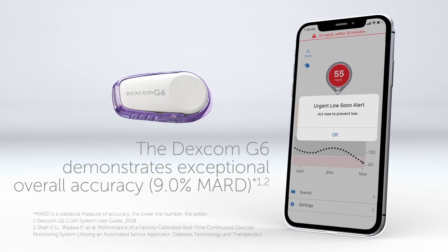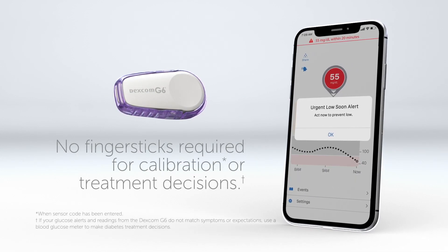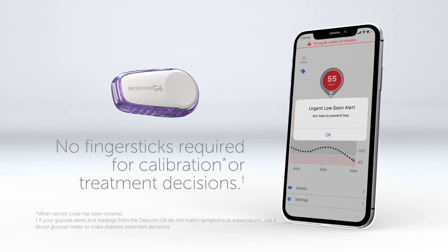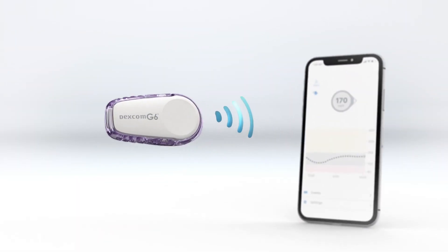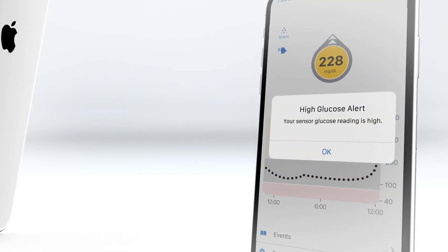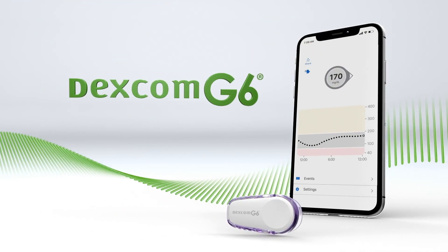The Dexcom G6 demonstrates exceptional overall accuracy. No finger sticks required for calibration or treatment decisions. Simple sensor insertion, continuous glucose readings, customizable alerts, and no finger sticks. Know more and control more with Dexcom G6.